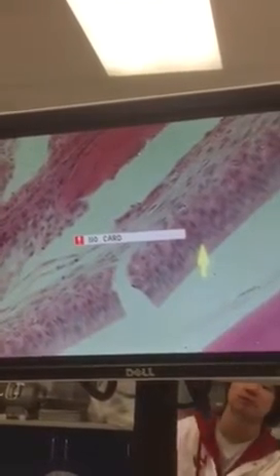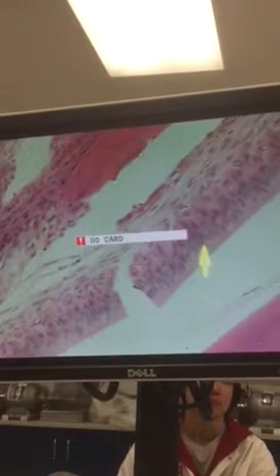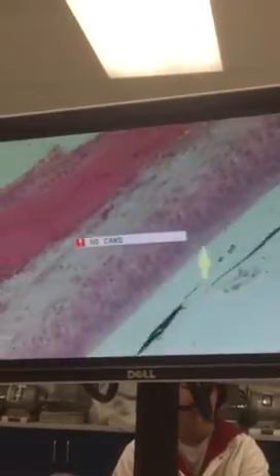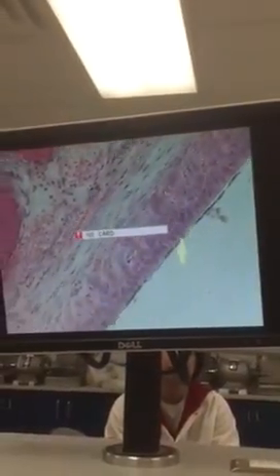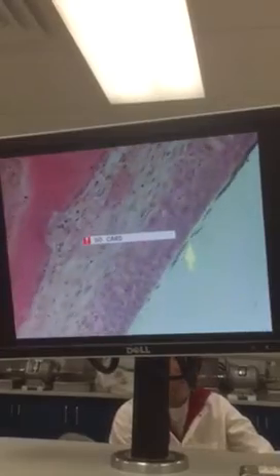They have laid down a basal lamina on the enamel surface to which they attach by hemidesmosomes. So right in here, and a little bit further along, we'll see something a little bit more typical. Like right in here, those are the ameloblasts in that protective stage. Now, since this is a rodent, we're not going to see a desmolytic stage.